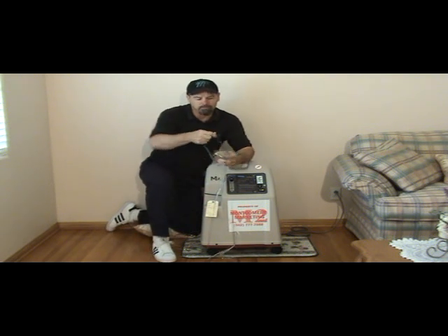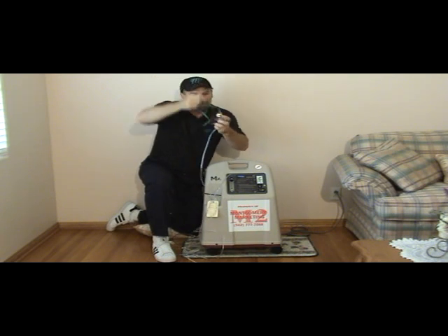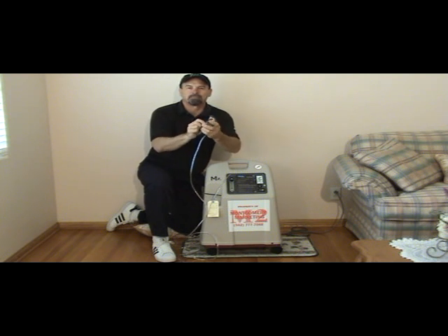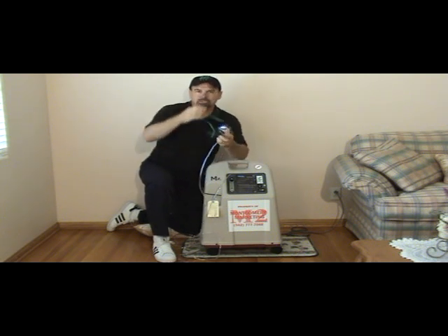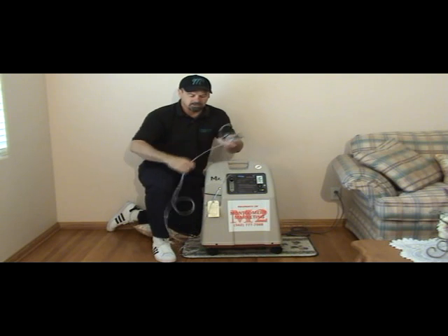You can loosen them up. It goes over the head of the patient. Then you can pinch it at the nose to keep it more in place, and it just goes on that way and they continue to breathe. Again, a mask should not be used unless you get at least 4 liters to the patient. Some places will even say higher. We do have high flow nasal cannulas, but an oxygen mask is available for patients in excess of 4 liters.